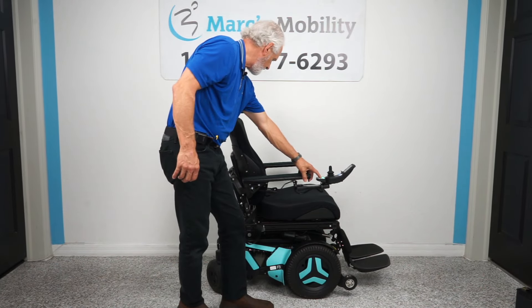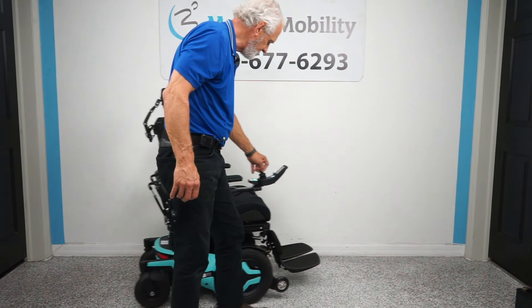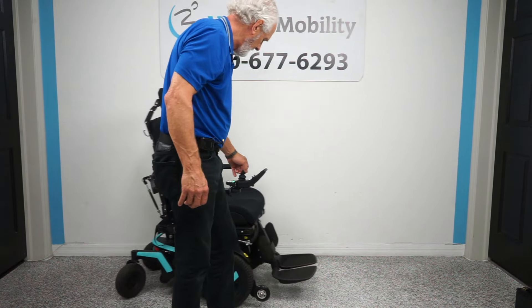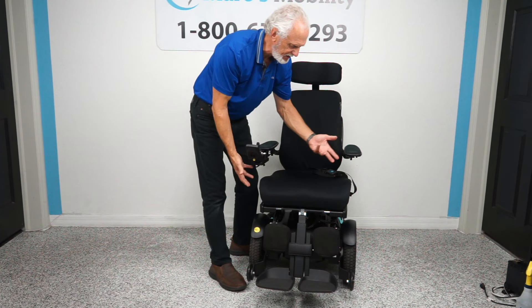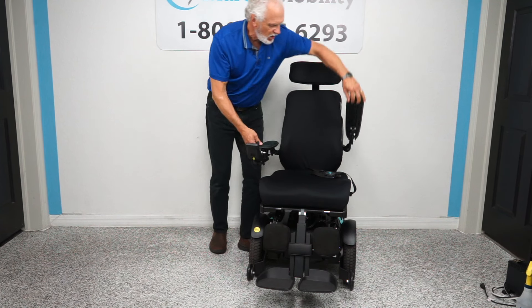Let's look at the seat on this chair. The seat is 20 by 20 inches — but as I said, it doesn't really matter because we can adjust the cushion, pull the cushion off and put another one on. The arms do flip up.